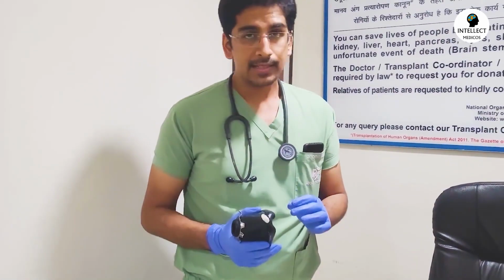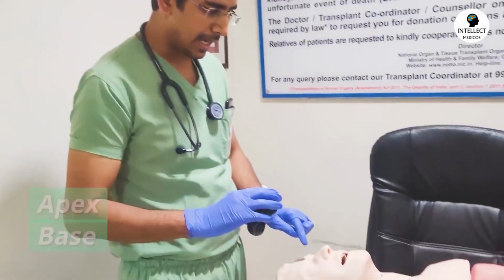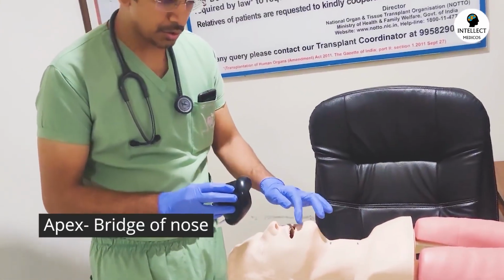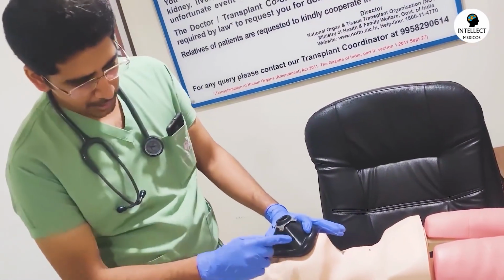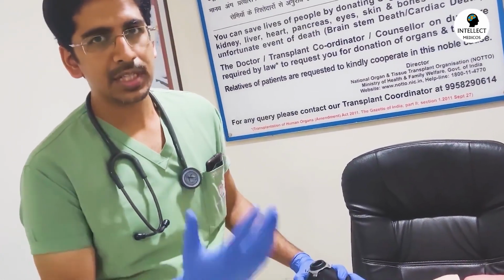Now how to check whether this is appropriate or not? This is the apex of a mask and this is the base. The apex should lie at the bridge of the nose, whereas the lower margin should go in the groove between the lower lip and the chin, like this. If you are not able to fit it, that means that size is inappropriate. You need to change. You need to have a larger or a smaller size, depending on the patient's face and anatomy.